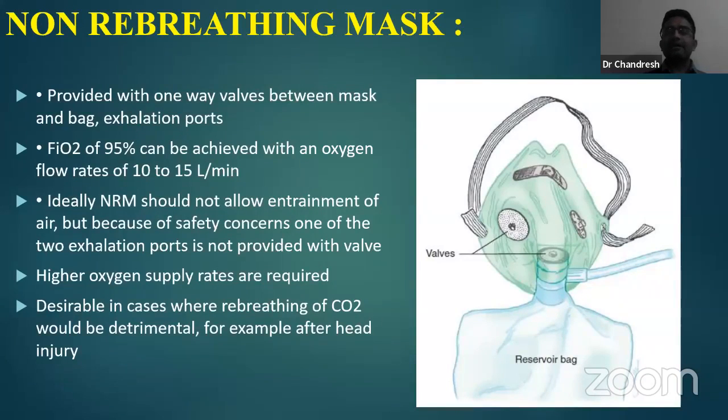Ideally, this NRM mask should not allow entrainment of the air, but because of the safety concern, one of the two exhalation ports generally is not provided with the valve. So still, you will find the valve on the one side. Maybe there won't be any unidirectional valve on the other side.